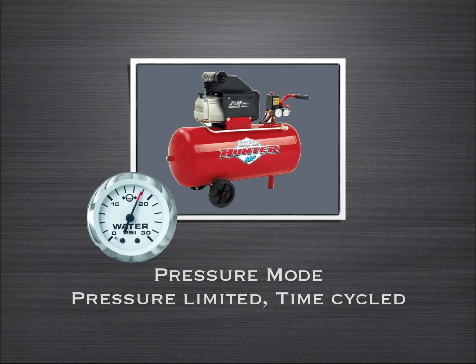So basically, I'm going to set the pressure, that's 20. I'm going to set the time, that's 2 seconds, and I'm going to set the ventilator, and that's called pressure mode. And since we are setting pressure, we want to measure volumes, because eventually we want to know how much minute ventilation the patient is getting.